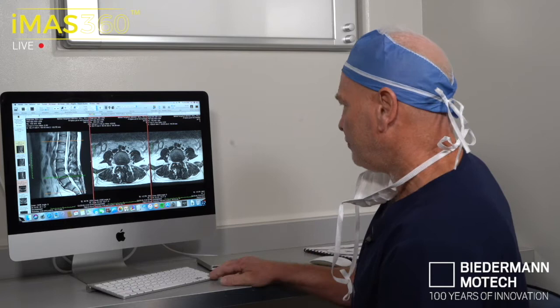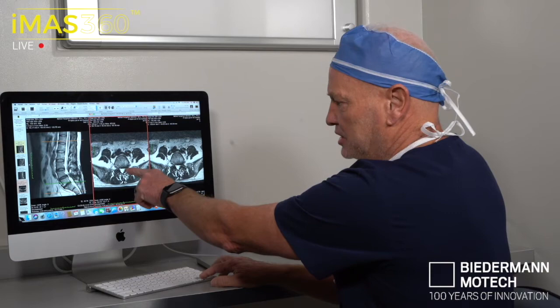When we go down to L5-S1, there's also some left lateral recess narrowing, and she does have some calf cramping and foot and ankle symptoms. So I'm going to make sure we do a small focused foraminotomy there. I don't want to destabilize it, but the focus reconstruction-wise is going to be L4-5.